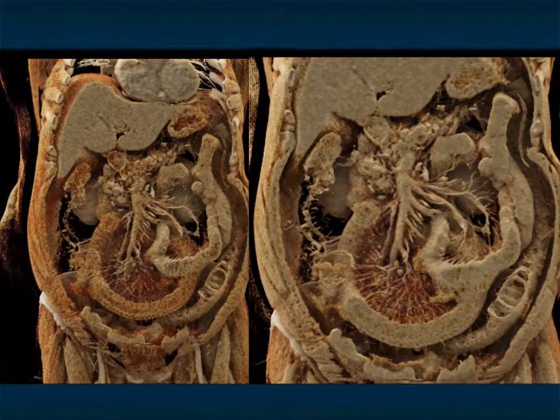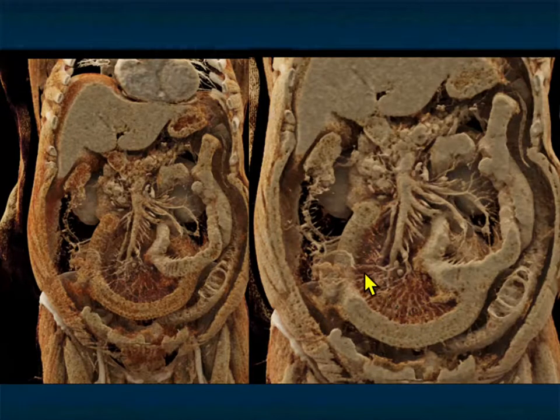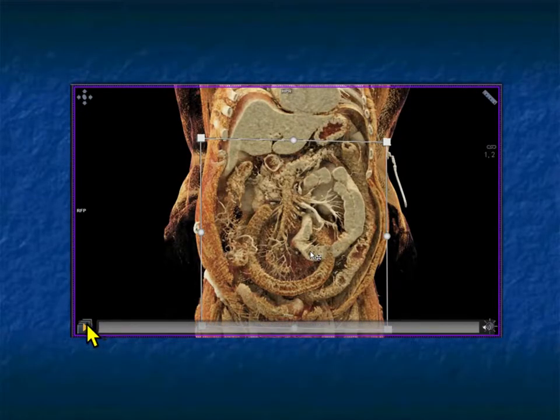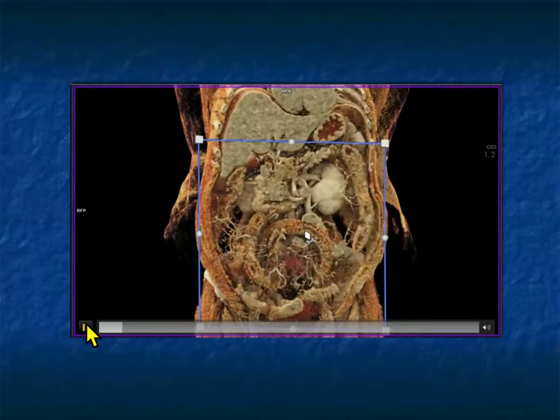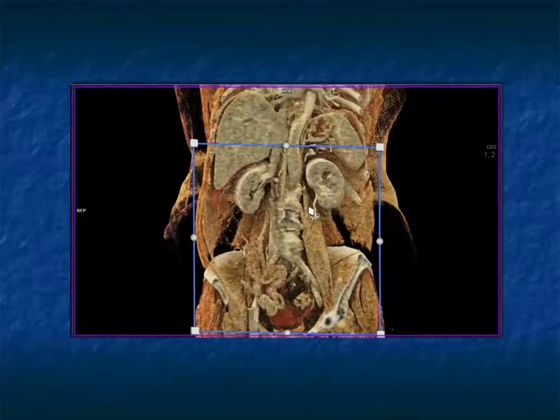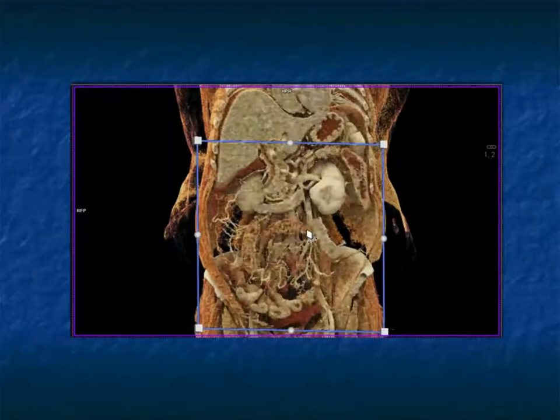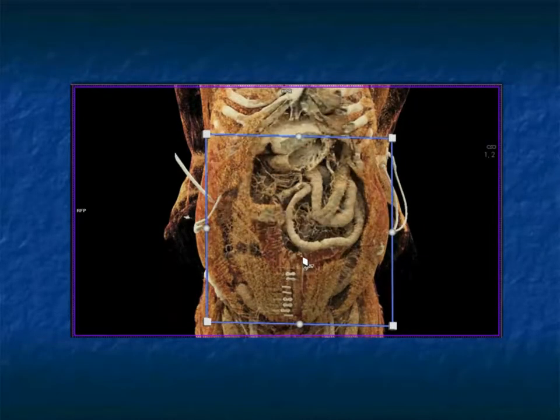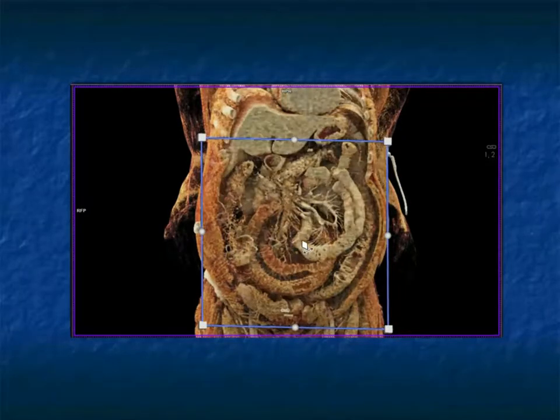By changing the rendering parameters, you can optimize things — here the bowel is less well seen because I'm accentuating the vessels more, and here the vessels are a little less well seen but you can see all the changes in the bowel wall. Interactively, this is how I would be looking at it — using the box to cut through, looking at the vessel including the portal vein and SMV thrombus, and looking at the extent of bowel involvement and orientation.